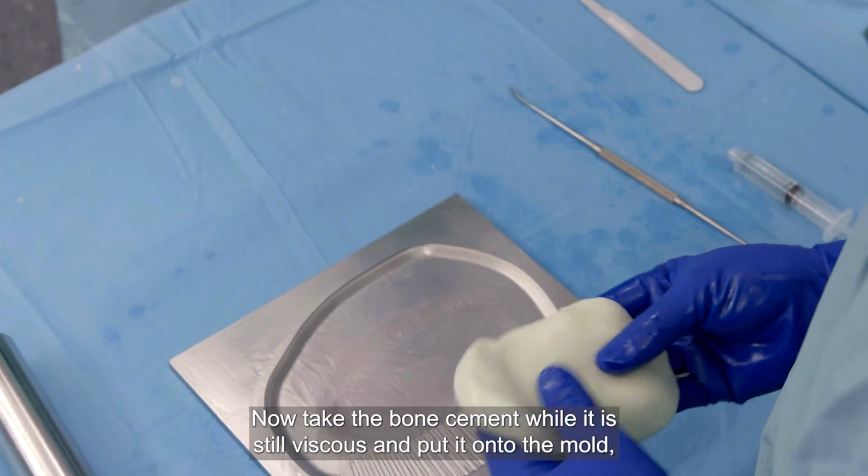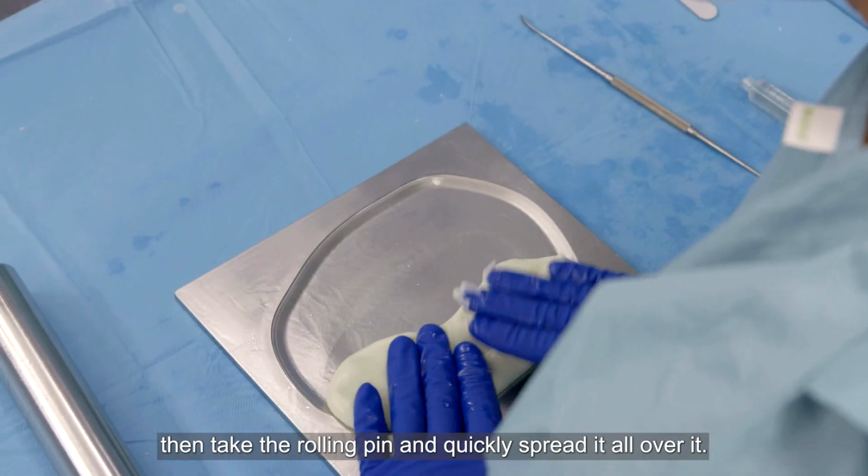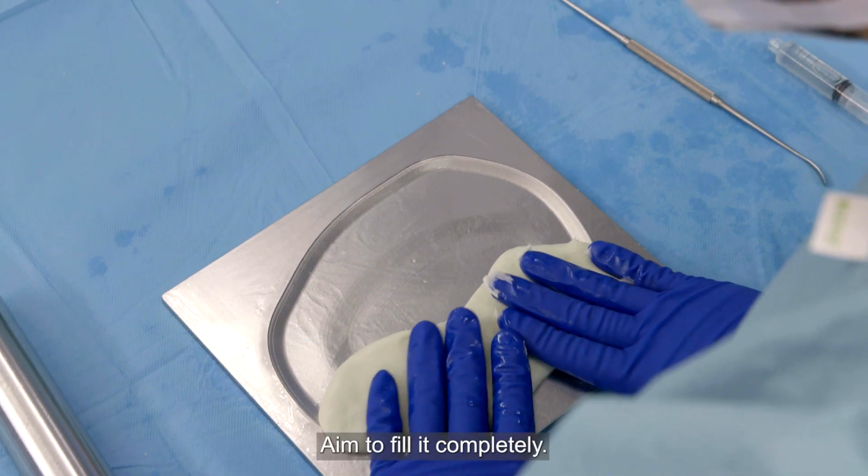Now take the bone cement while it's still viscous and put it onto the mold, then take the rolling pin and quickly spread it all over it. Aim to fill it completely.